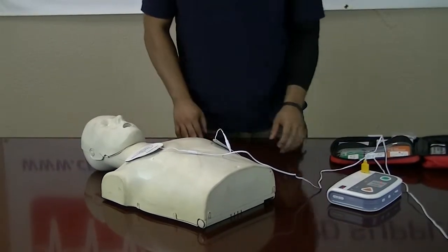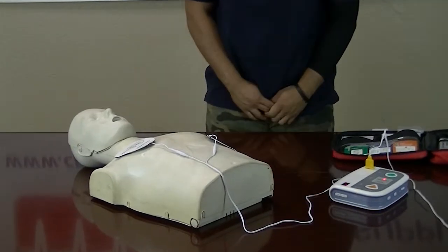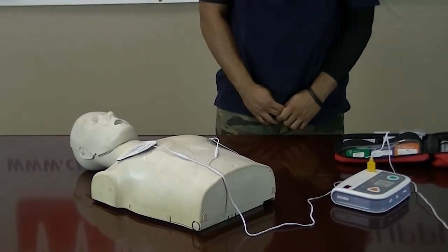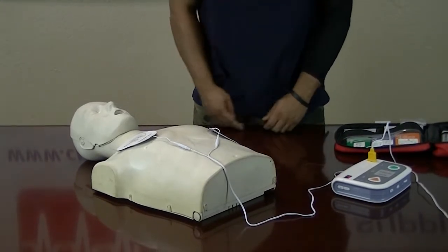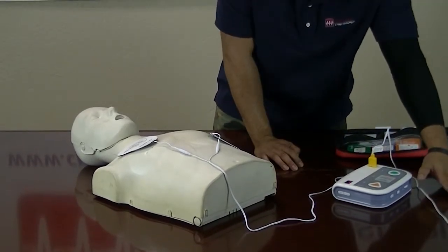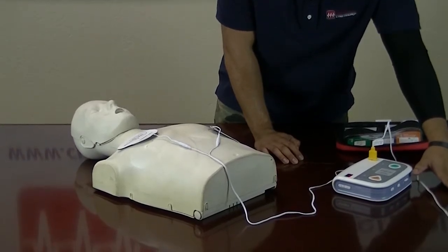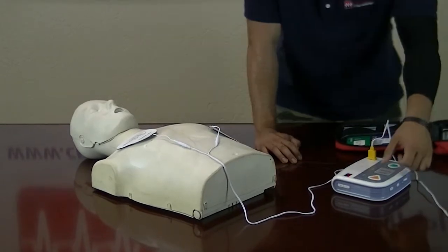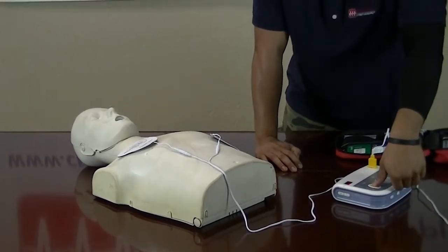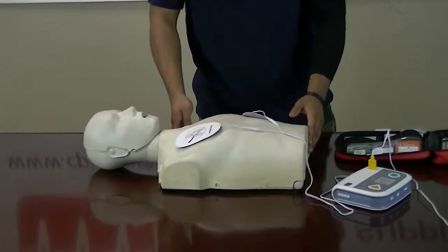Analyzing heart rhythm. Do not touch the patient. Shock advised. Charging. Stay clear of patient. Deliver shock now. Press the orange button now. Shock delivered. Begin CPR.